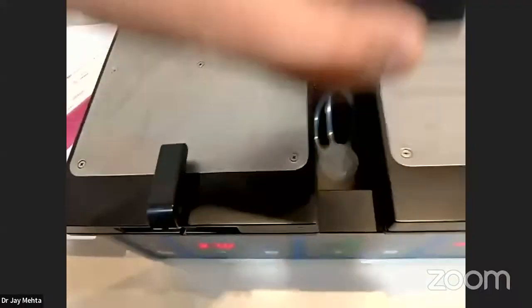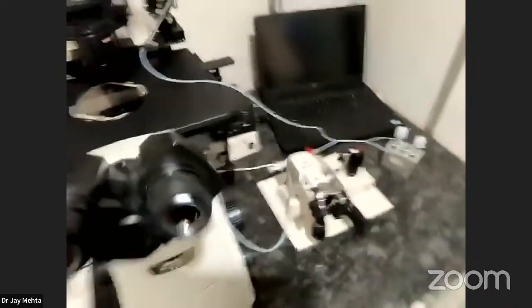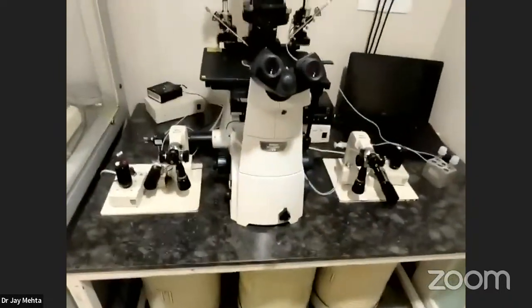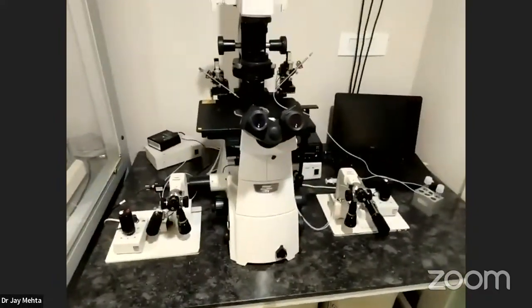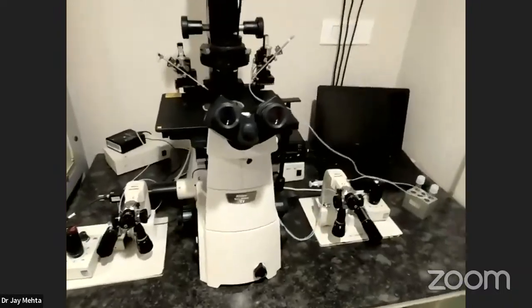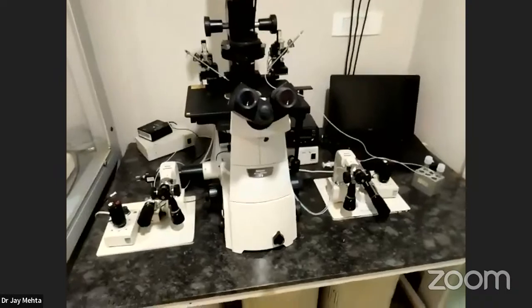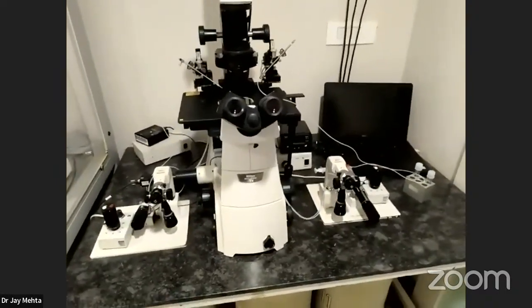I don't know if you can see it through the camera, but humidification is an extremely important thing inside an IVF laboratory for any incubator, which is what people often don't realize. Quite a lot of times that bottle is blocked, which gives rise to poor quality embryos, because there is no humidification. When there is no humidification, the media inside the culture plate cannot absorb the gas inside.